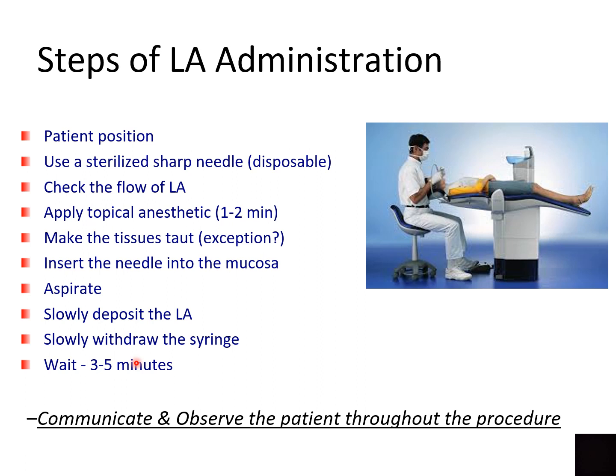And finally, what is very important throughout LA administration is that you must communicate and observe the patient throughout the procedure. Maintain good eye contact, which would allow you to gauge if they are getting too uncomfortable or if they are experiencing any medical emergency. So that's really, really important. And the communication is also important to reassure the patients, explain to them what you're doing, what they should expect. And then you would have patients who don't want to hear anything. So that's something you would work out prior to administering the LA. But in any case, good, effective communication is very helpful in most patients.